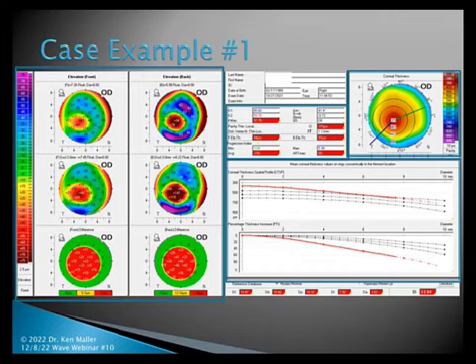The three gray lines in the upper box, those three arcs, that's normative data out to 2 standard deviation units. And you can see my patient is the red line way above that, which is indicating that this is clearly keratoconus. There's no doubt about that. And then the percentage that the thickness increases, again, those 3 gray lines represent 2 standard deviation units, with the middle being the average. And again, this particular patient is way, way below that with that red line there. So we're pretty certain we have keratoconus here. There's no doubt. Down at the bottom there, those are the numbers that we would use to describe keratoconus. And yes, everything is red because there's no doubt that we're dealing with keratoconus here.